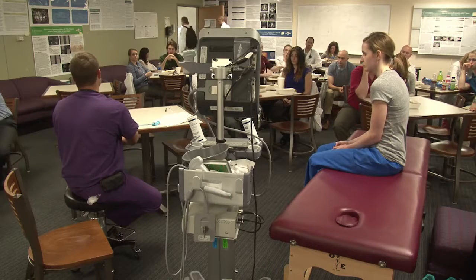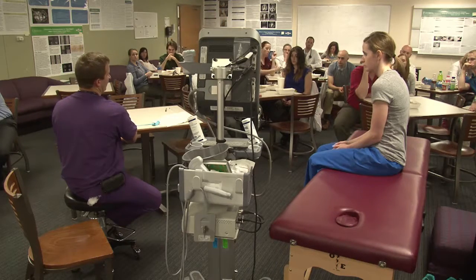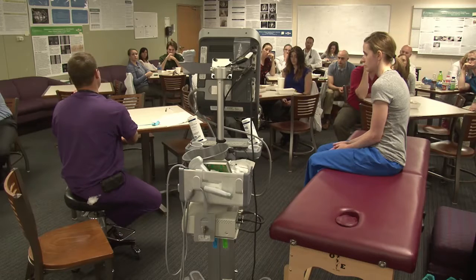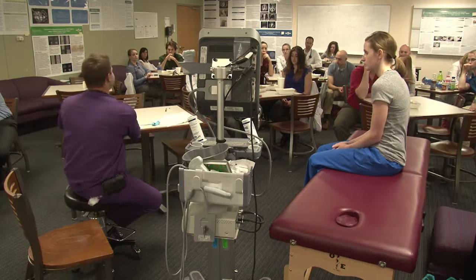It hurts just as much as a regular stick. Okay, there are some institutions that use lidocaine on every stick. I don't think it's necessary because it hurts just as much one or the other. But if you're making multiple passes, definitely consider some lidocaine.